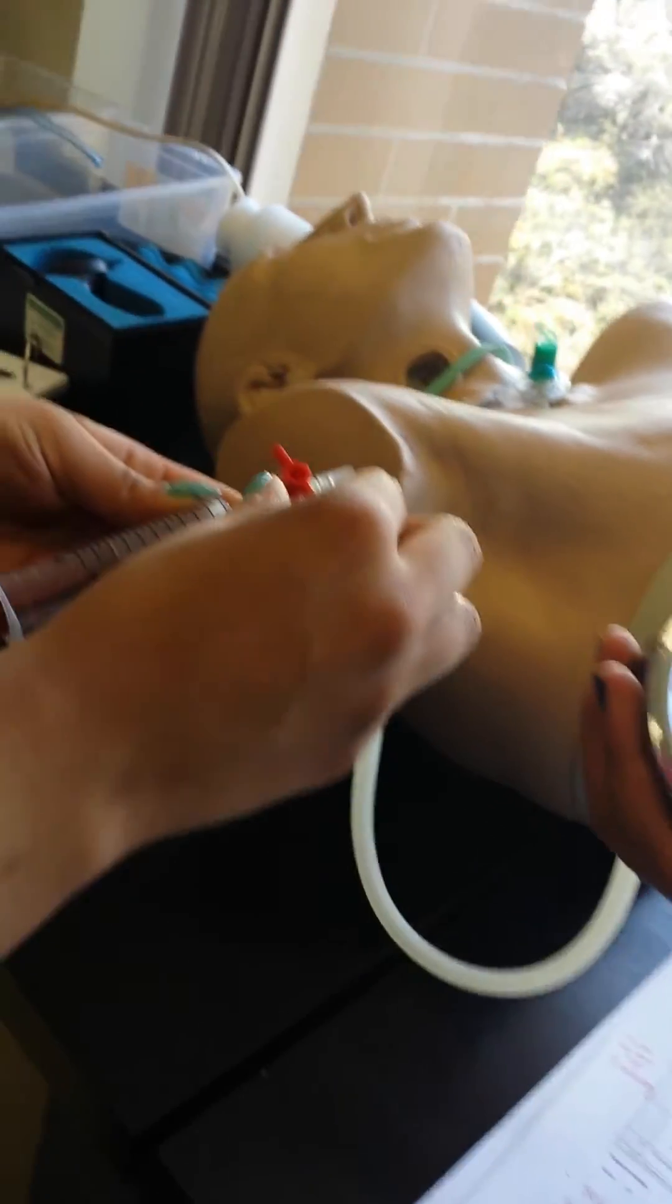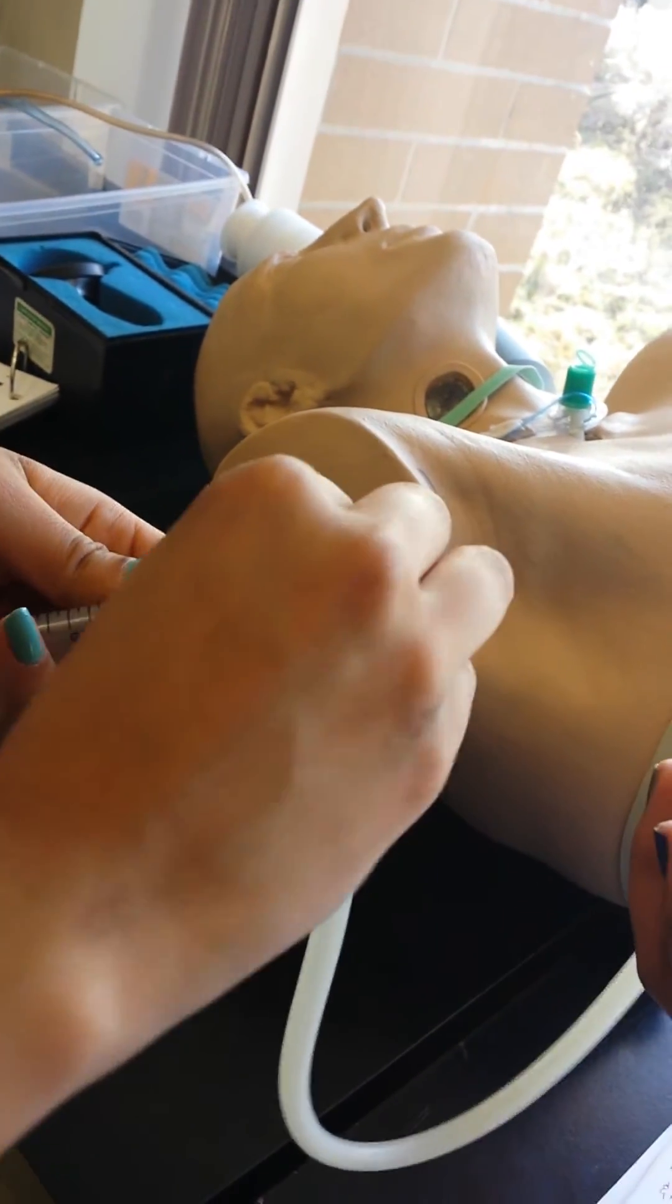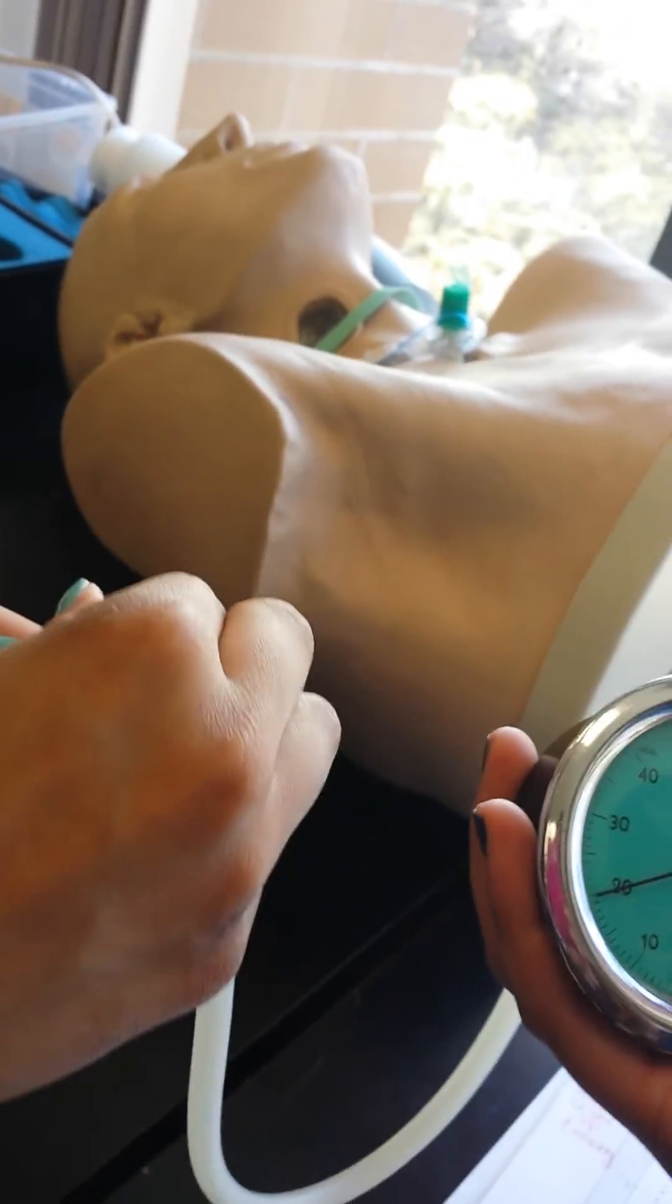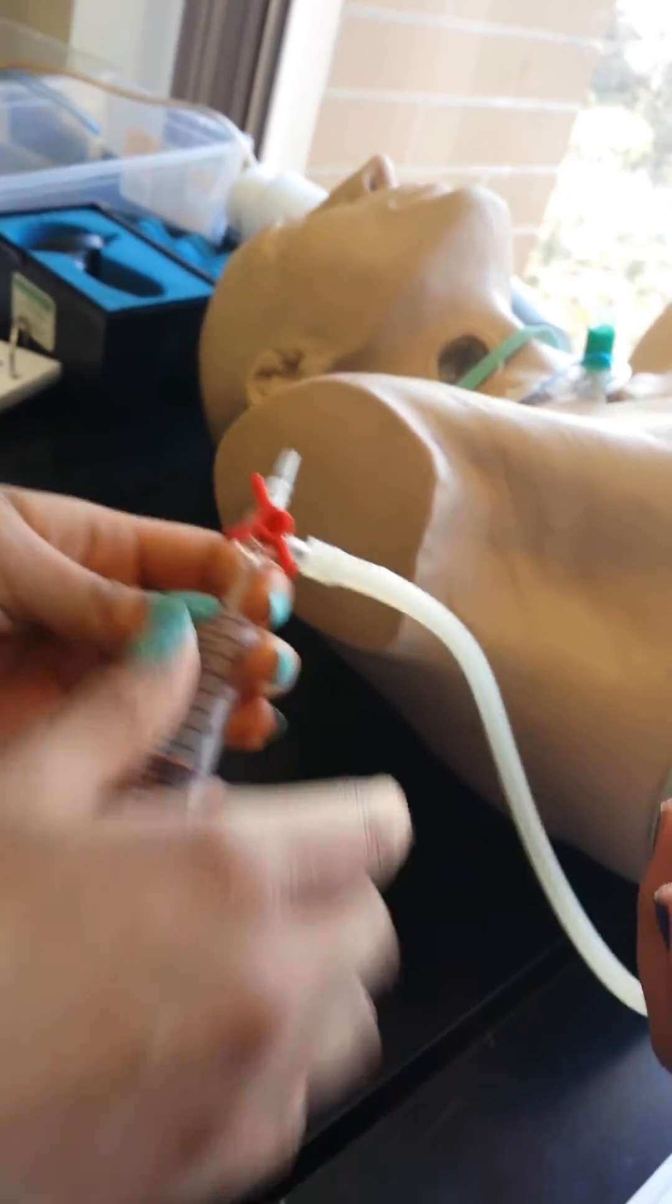You're at 20, so that's good. So now we have to safely put this in before we put it into the patient. So now she's shut off all the lines so that we're not going to lose pressure.